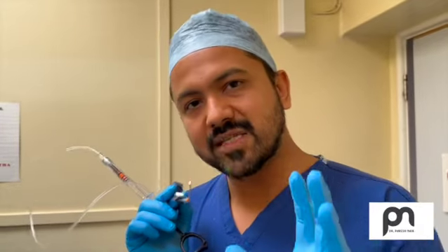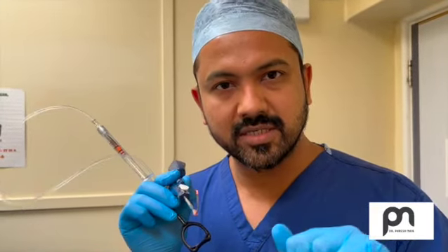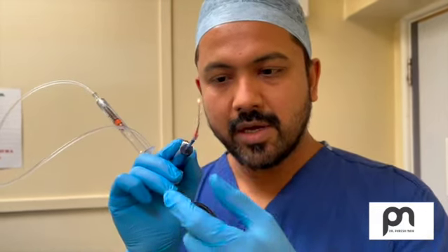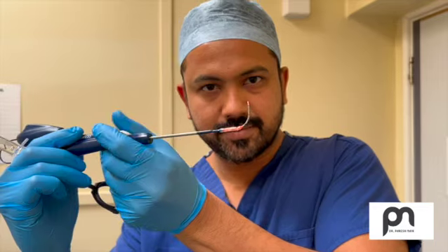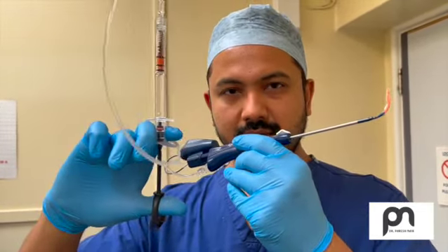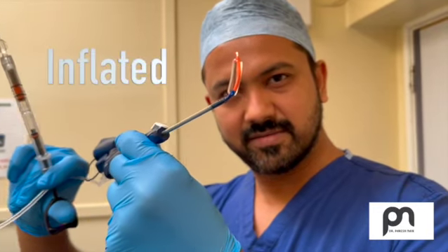So once you're going, imagine we are going to do it for, say, the frontal sinus. After identifying the axilla and decongesting, we have to introduce the probe, and the moment we see the frontal recess, we introduce this probe inside. And then this is the switch that advances the balloon. Can you see this? It will advance, it will go on the ostium, and then you ask your assistant to inflate this. They will inflate, and as you can see, the balloon has inflated.